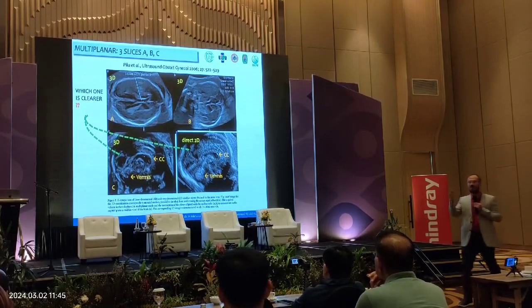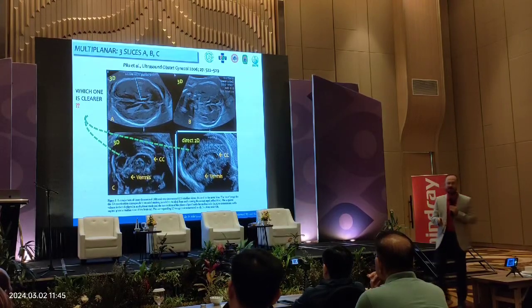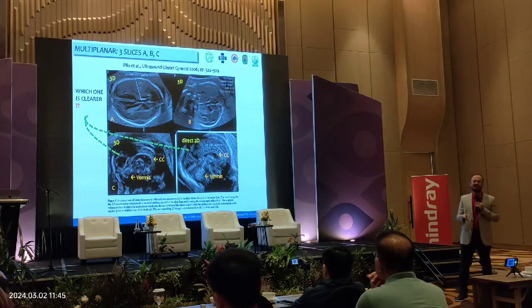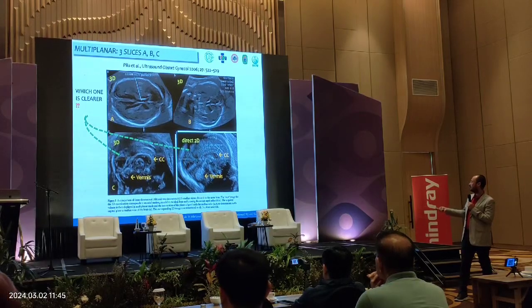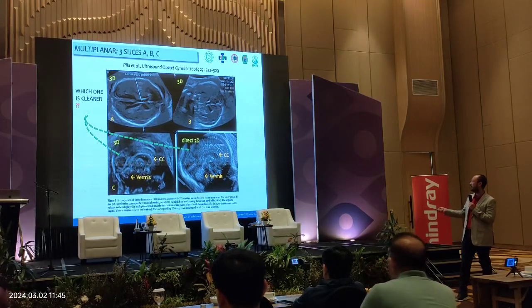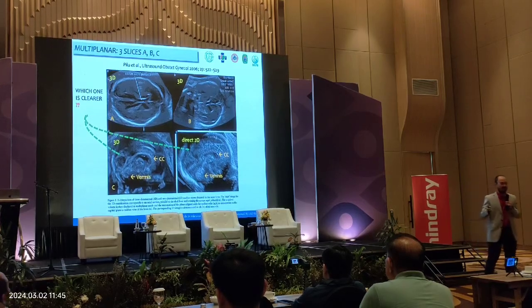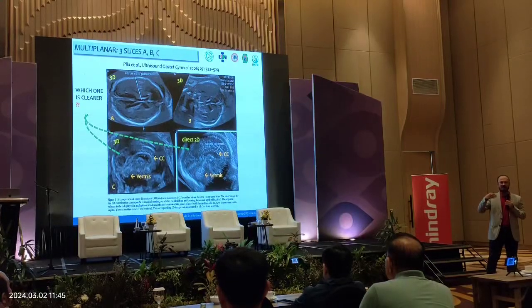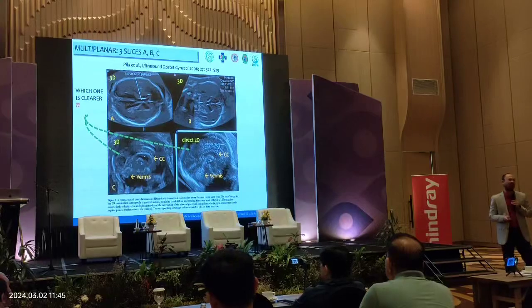So what Prof. Leonard Poon has told us, Professor Wu Xing also, use transvaginal often, from now. So we can see morphologically, anatomically it is very clear compared to the three-dimensional using a transvaginal. But we don't know, the machine technology is getting higher and higher, and everything becomes almost comparable.